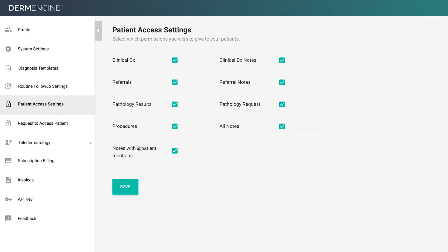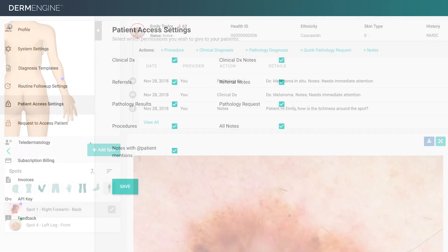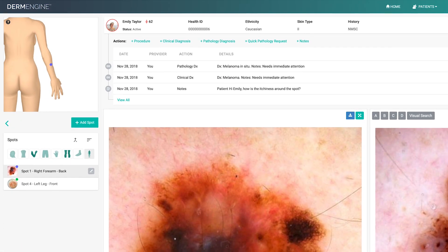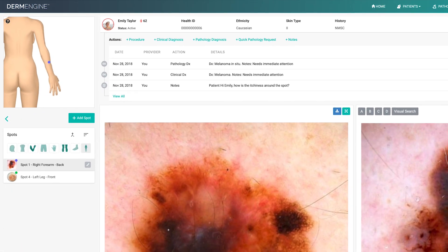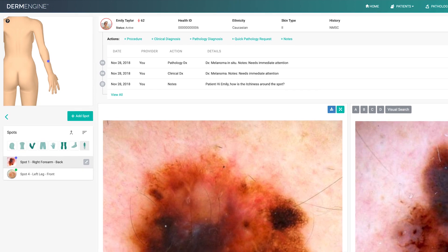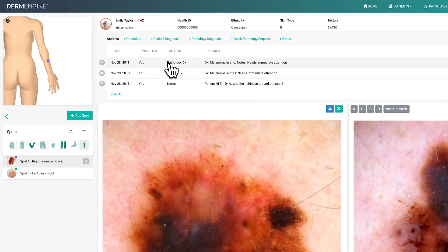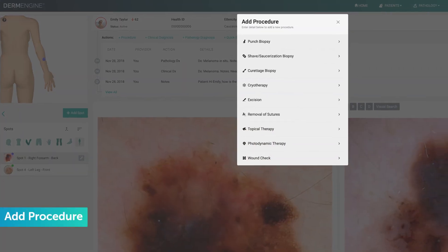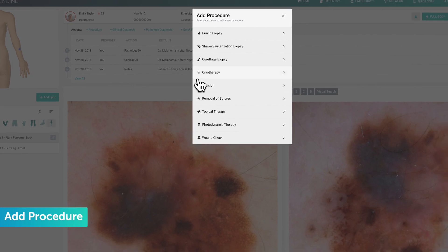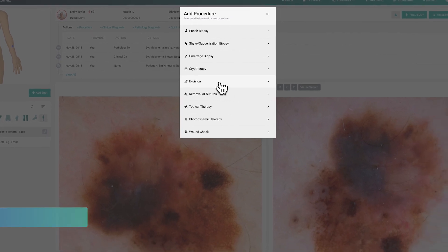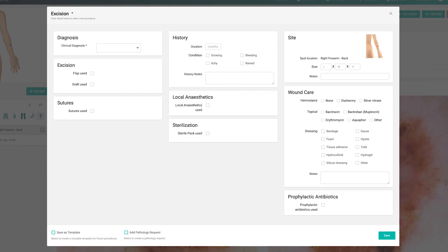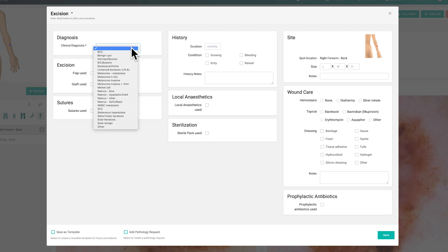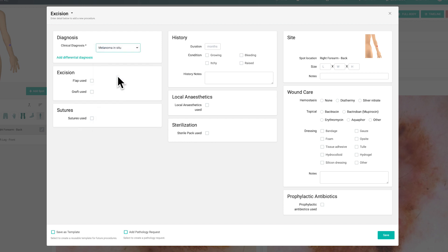Let's head back to the patient profile to document additional information, such as procedures. Simply click add procedure and select the type of action performed. As you can see in this form, you can document as many details as you'd like, with clinical diagnosis being the only required field.